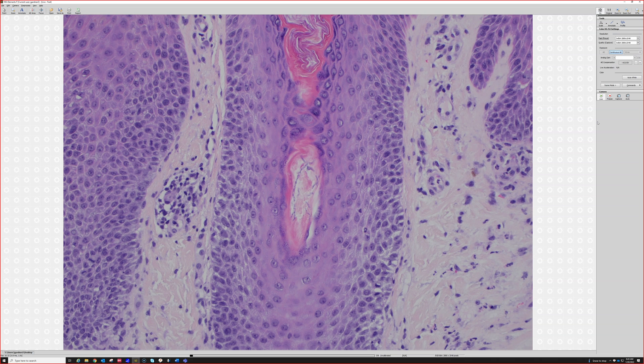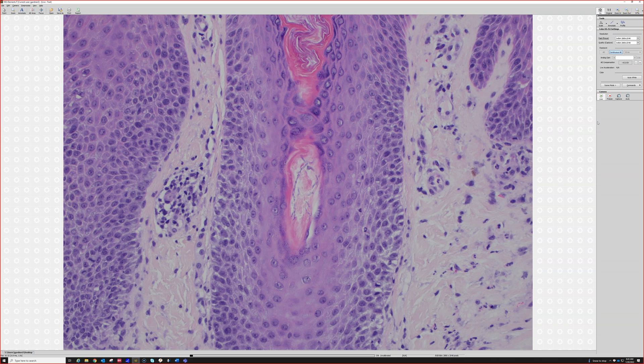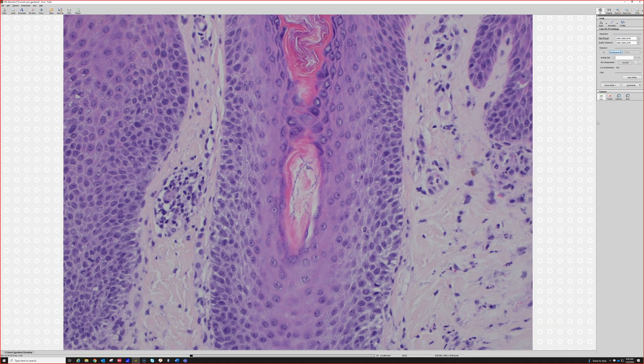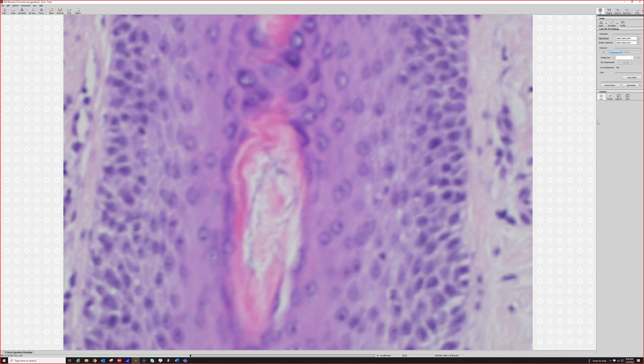KOH or a skin biopsy can sometimes miss those things, even if the pathologist is not missing it. They just may not be showing up on the sections.